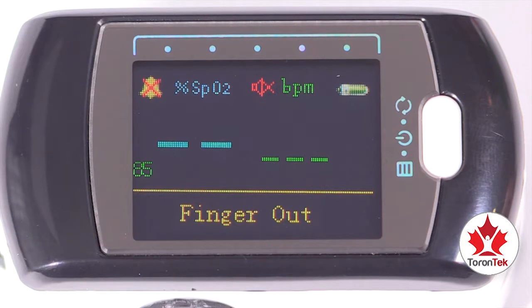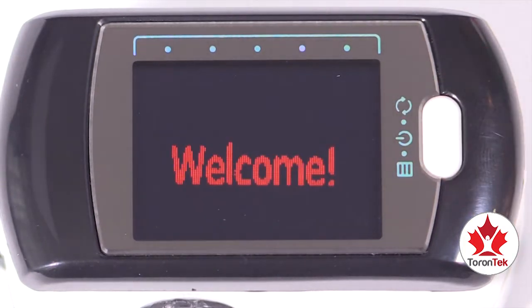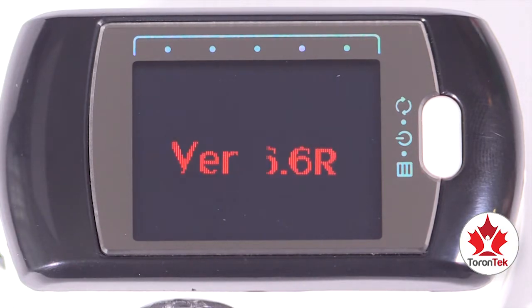If no pulse activity is detected, the device will shut off automatically. So access the menu screen quickly before the device turns off.